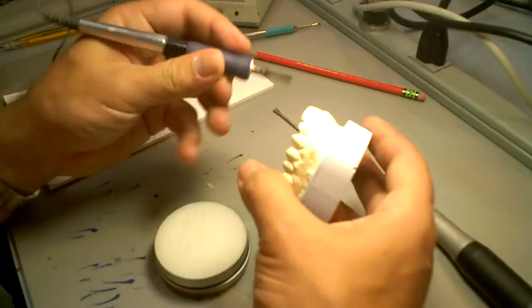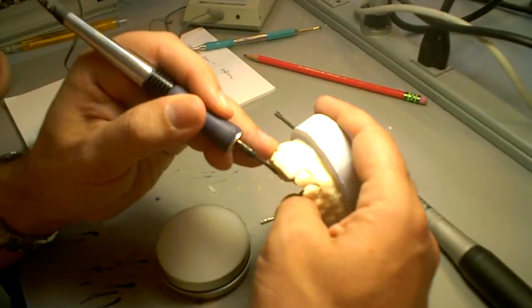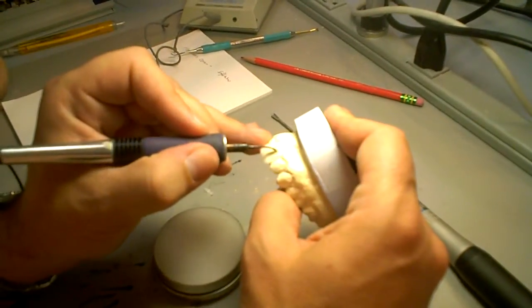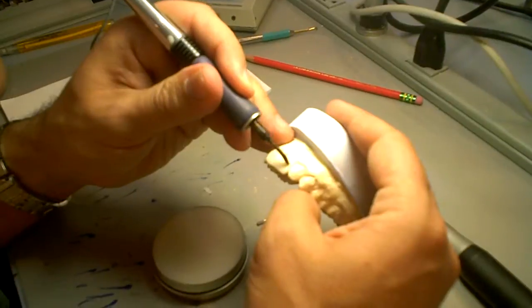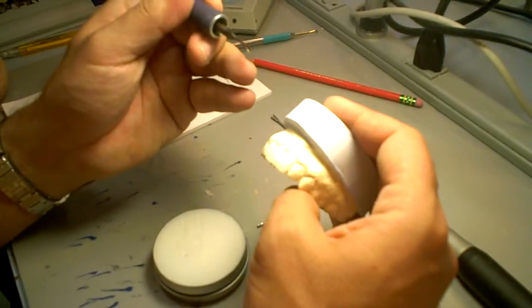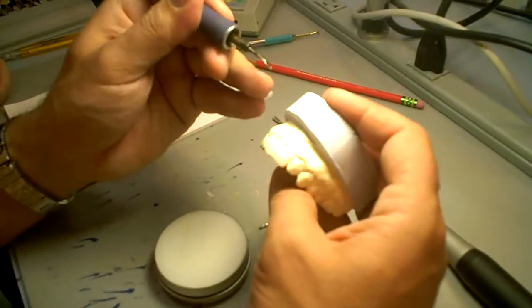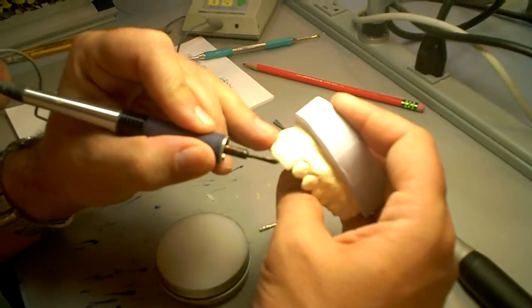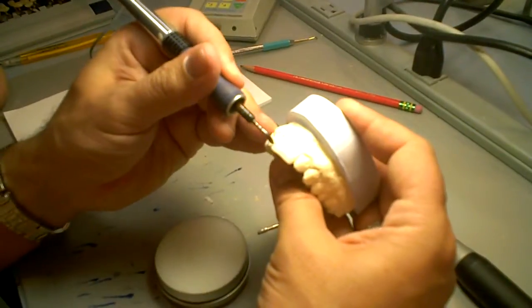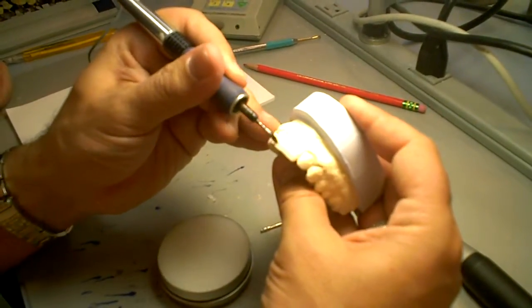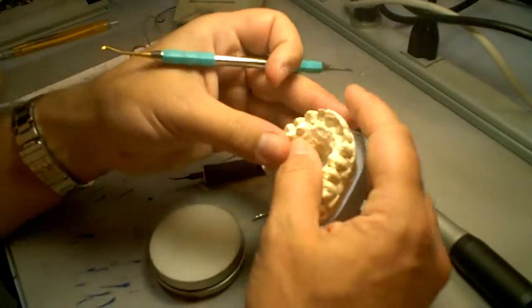I've got my two centrals coming around this edge a little bit here. And I love doing diagnostic wax-ups of anterior teeth. It's so cool. Now I'm going to start carving just a little bit on these two guys. A little bit of bulk on this distal. So I'm going to grab this little instrument here.